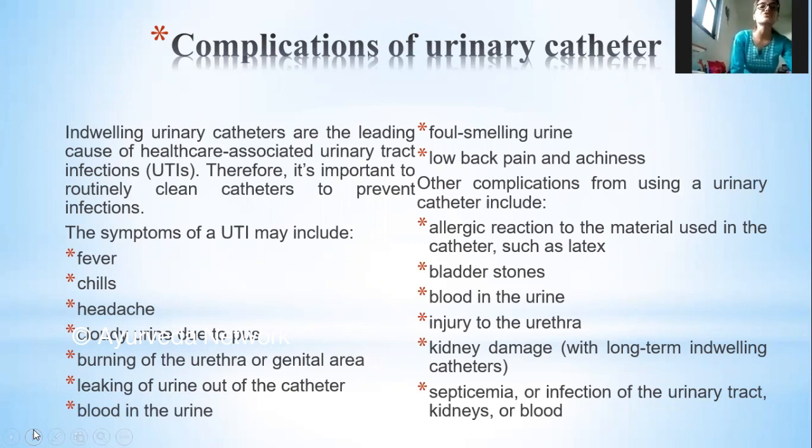So this one is the common complication, that is UTI, and again you may find foul smelling urine, and the patient may have low back aches, and may feel a little icky if he has acquired a urinary tract infection. Other than UTI, other complications could be allergic reaction. If you're using a catheter made of latex, the patient could be allergic, so you may experience some sort of allergic reaction.